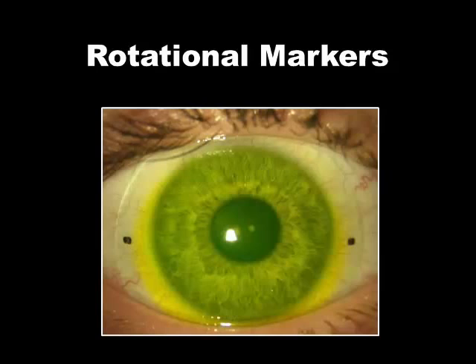Does it sit at the same axis as any corneal astigmatism that might exist? And my experience is the two do not line up very regularly. In other words, if you had a spectacle Rx of -6, -3, axis 180, it's not common to see your scribe markers that find the scleral toricity lined up at the same axis as your refractive cylinder.